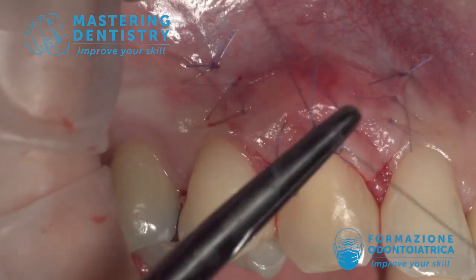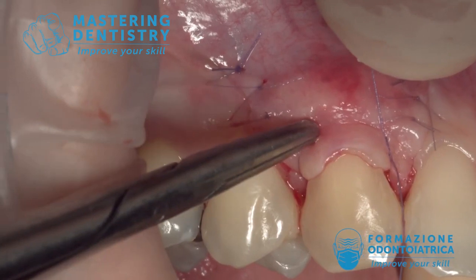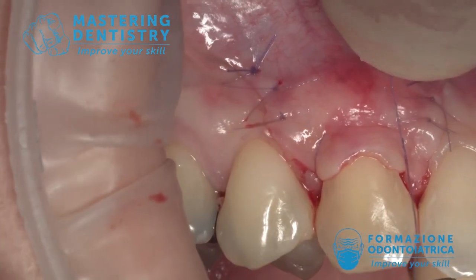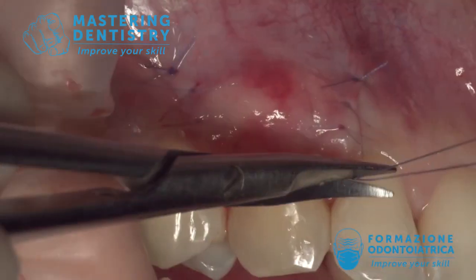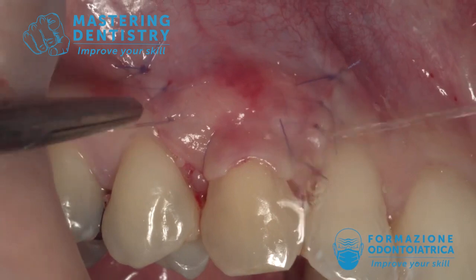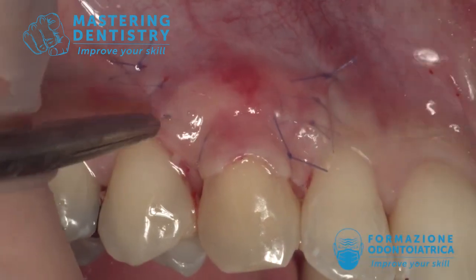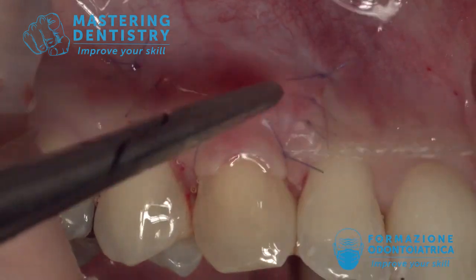The recession is now over-covered, but that's not a problem because during healing it will contract a little bit in the apical direction. You see, underneath the flap we have a very thin flap with no muscles underneath — only the connective tissue graft — and everything is very beautiful.